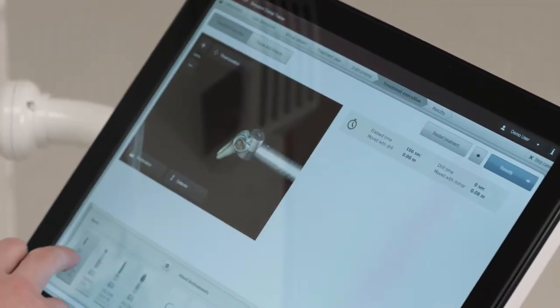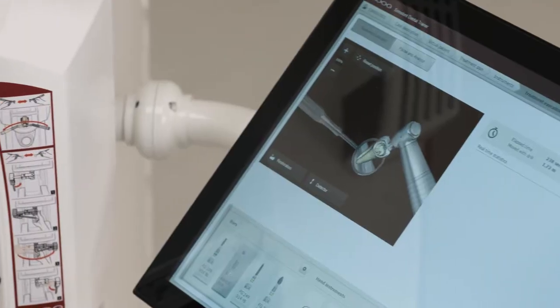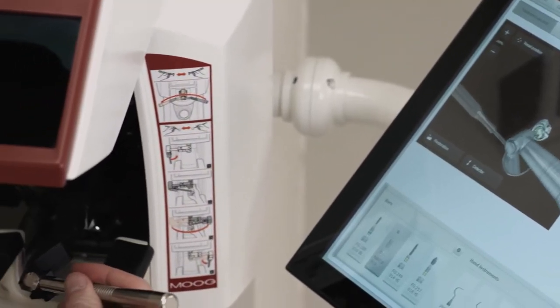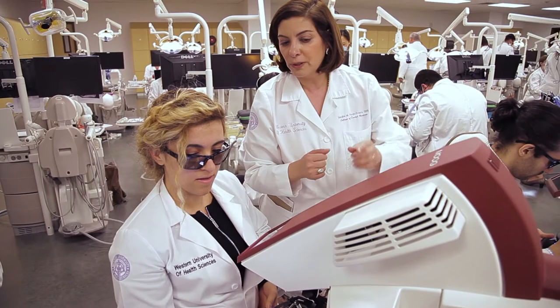A student can decide on treatment, on design of preparation, restorative material selection, and then they can prepare the tooth in order to receive a restorative material. It reaches all aspects of clinical dentistry.